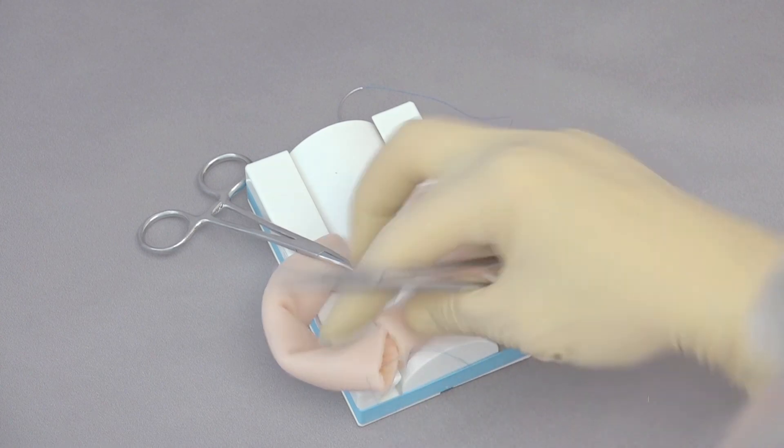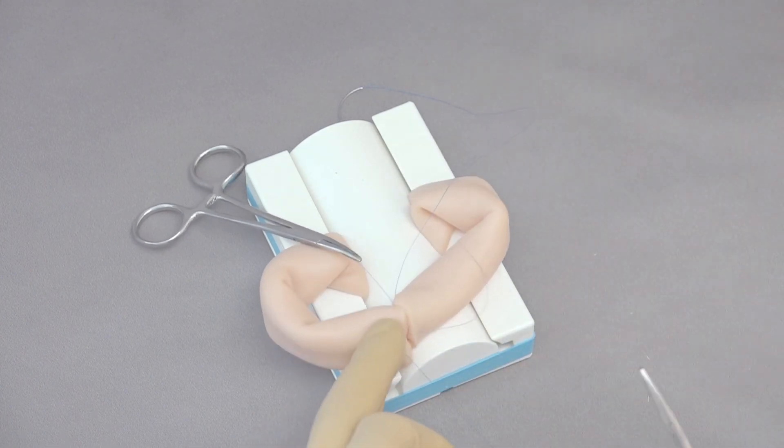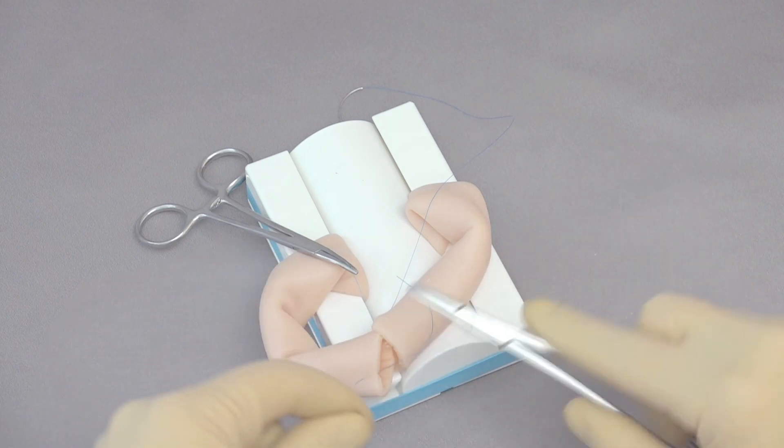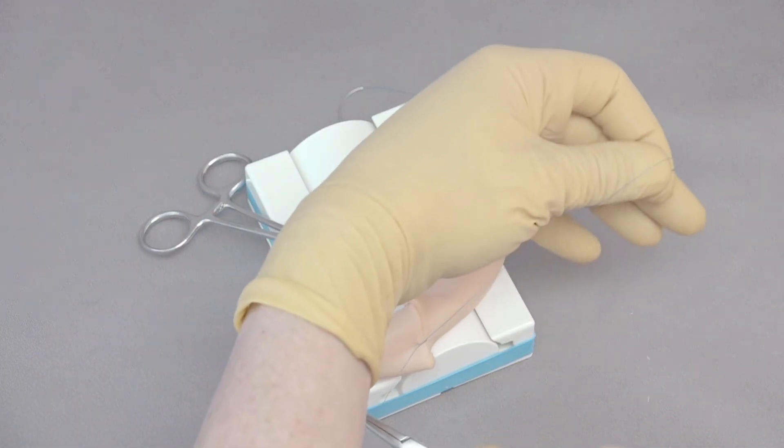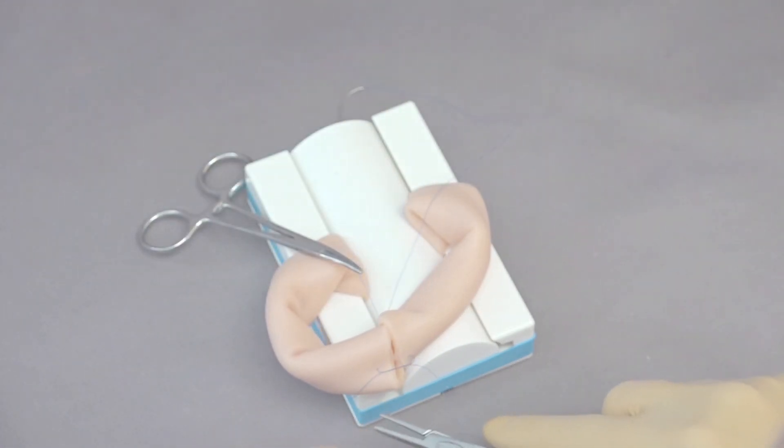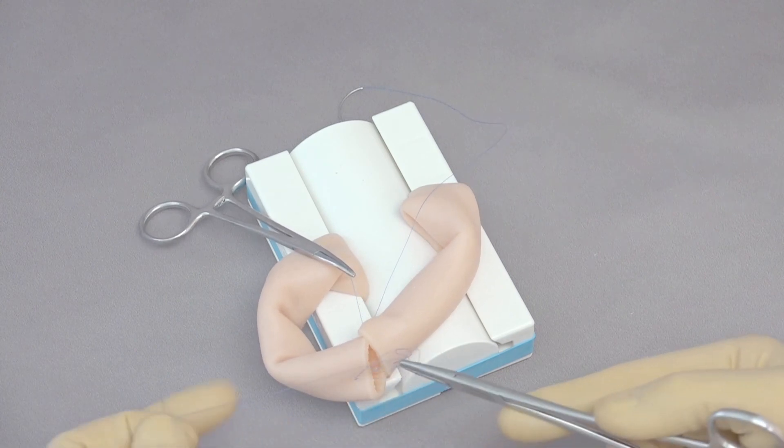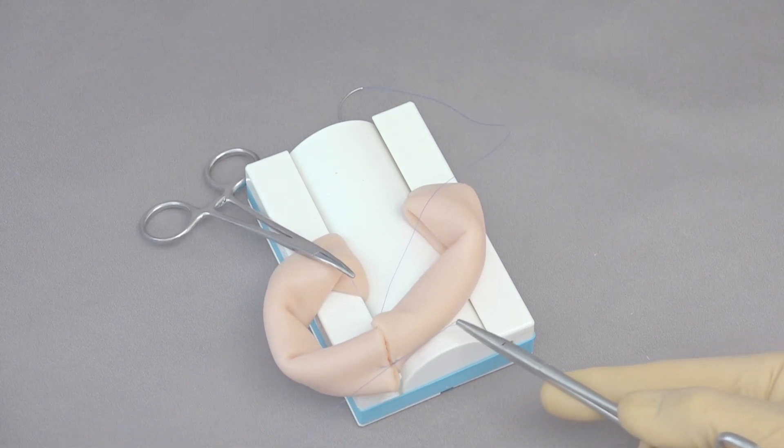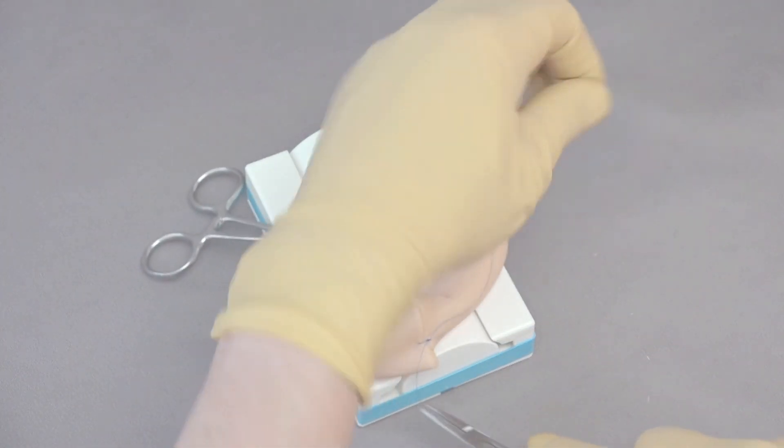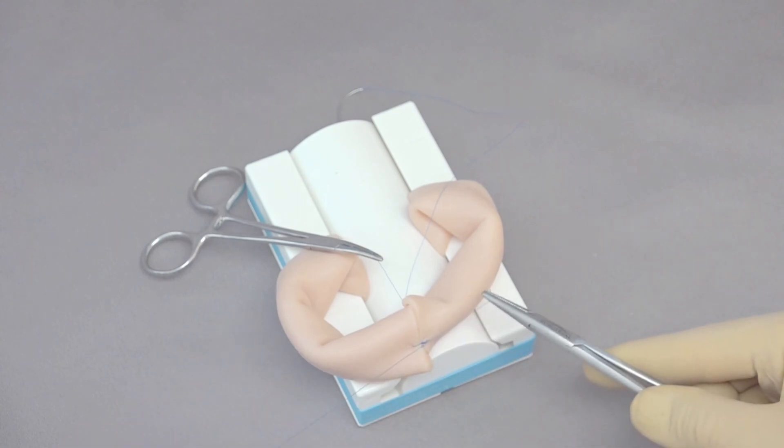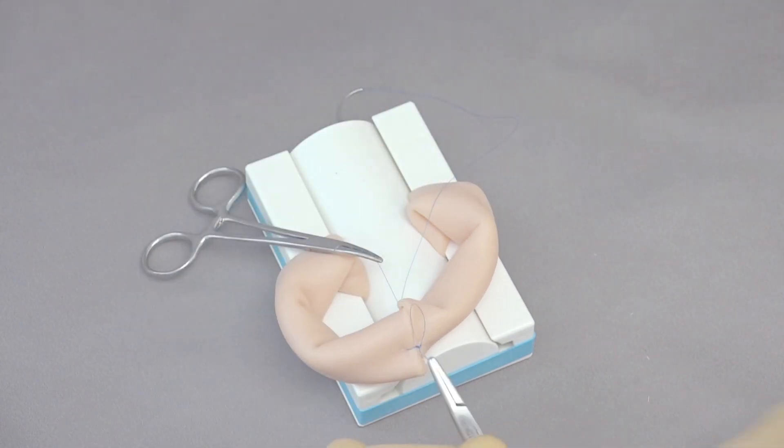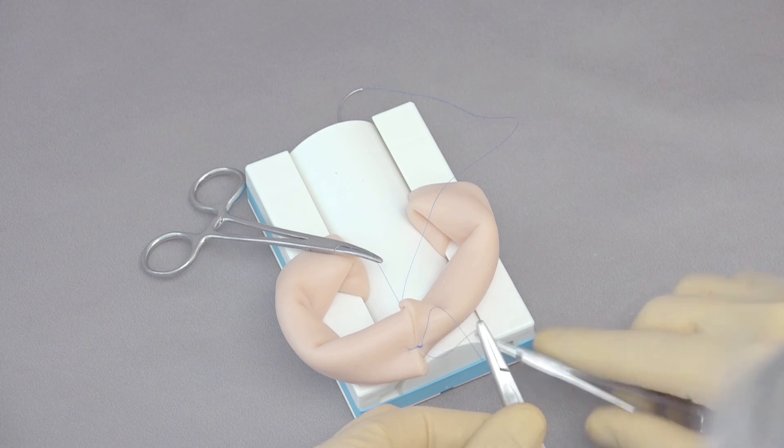I'm going to bring this together. Square knot so the needle holder is going to go in the middle of the loop. Pull that together. Because it's monofilament it loosens up a little bit, but I can snug that down on the next throw. And again I can use a hemostat to support this side.